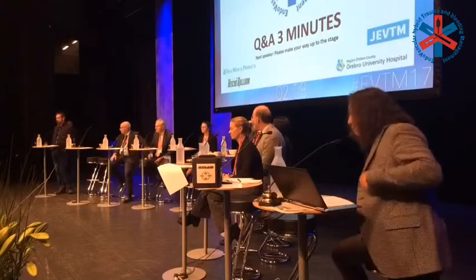Yeah, maybe just on that point, as I said, we see a lot of penetrating trauma, very severely injured patients. But thinking back over the last year, I could think of 3 cases that I thought may have benefited from the use of REBOA. I'm not saying I could think of 30 cases or 300 cases. I think the indications are still quite limited. And I certainly won't be using them left, right, and center in my practice.